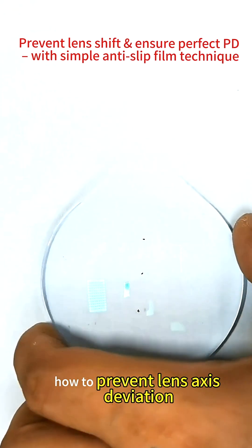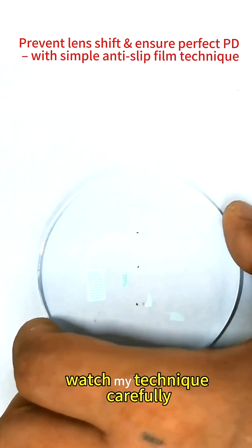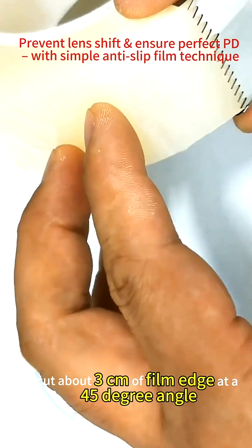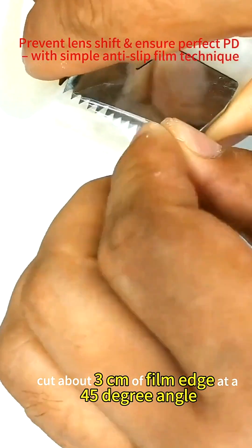How to prevent lens axis deviation and ensure accurate pupil distance? Watch my technique carefully. Let me demonstrate again. Cut about 3 centimeters of film edge at a 45 degree angle.